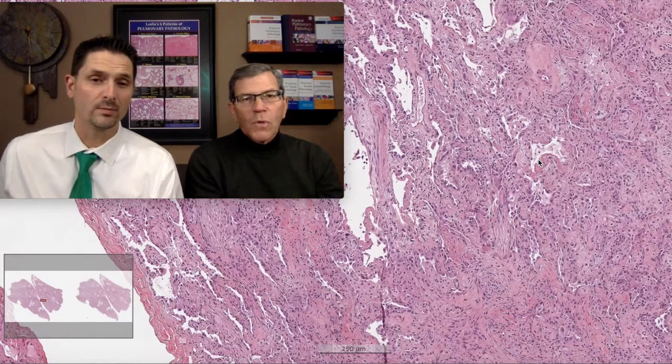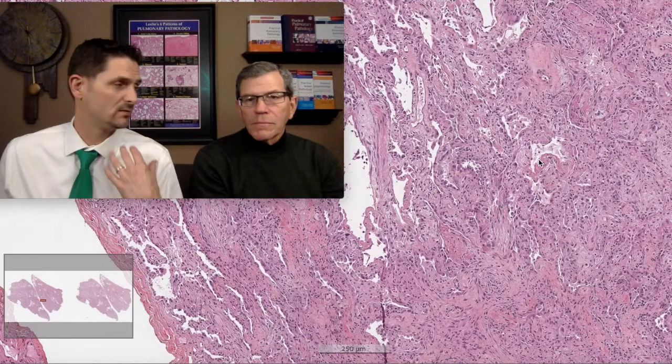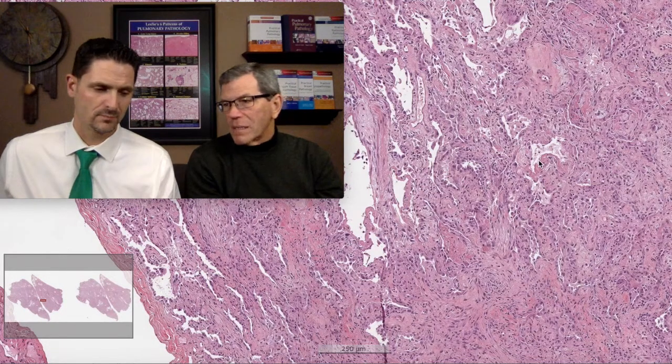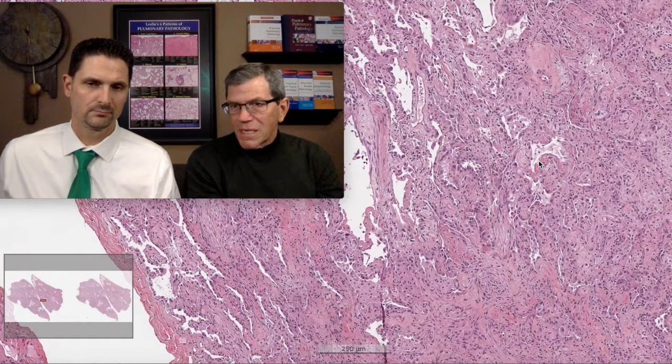F for fish: foreign material. Whether that's inhaled, aspirated, or injected foreign material — vascular associated, like embolic. People can embolize with chemotherapy and radiation and get DAD in that setting. So you've got to look around for foreign material, polarize the tissue, make sure the patient isn't injecting crushed-up opiates or tablets.